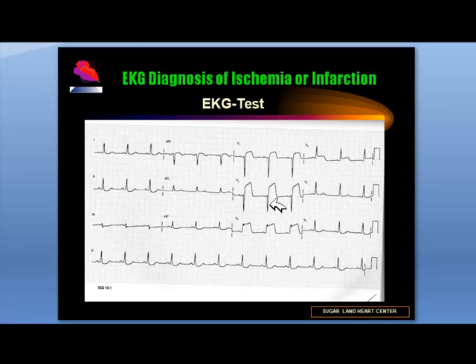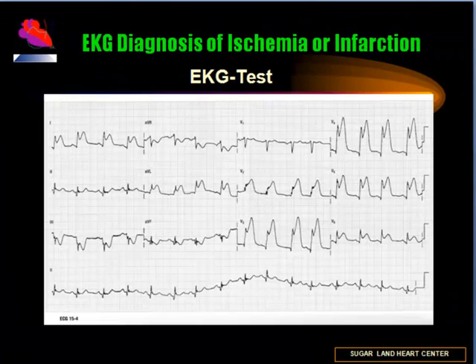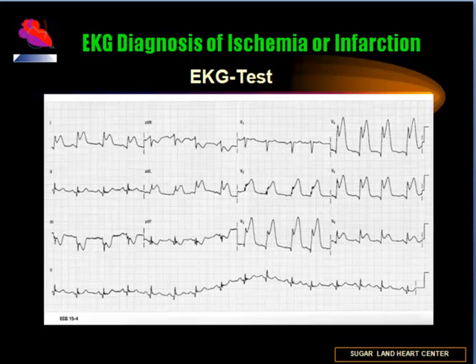Incidentally, you can also see some minor ST depression in the inferior leads, which are reciprocal changes seen with anterior myocardial infarction. Now here is another electrocardiogram — what is your diagnosis?